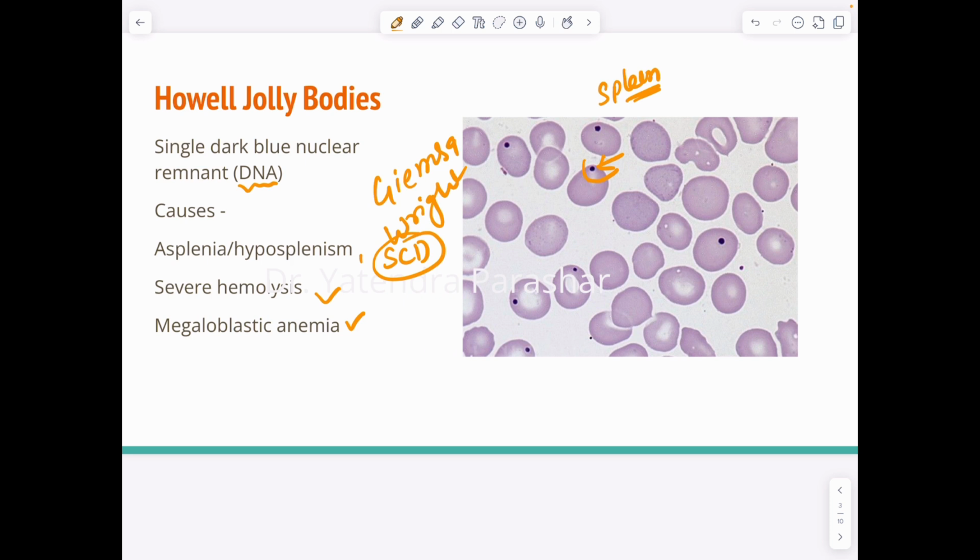Sickle cell disease is associated with autosplenectomy. Due to the recurrent thrombotic events, the spleen size is reduced and a shrunken spleen is seen in sickle cell disease, and this is known as autosplenectomy. Detection of Howell-Jolly bodies thus is a useful marker of splenic dysfunction, and it aids in identifying a patient at risk of infections with encapsulated organisms such as meningococcus, Haemophilus influenzae, and Streptococcus pneumoniae.